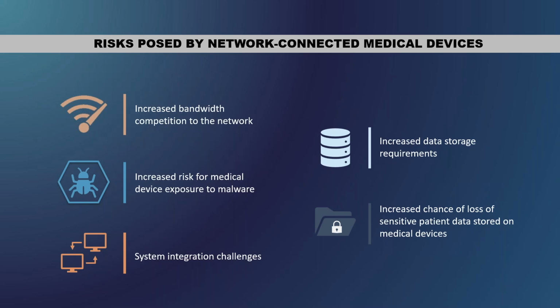Being on the network increases the risk of malware exposure when it comes to inadequate port or protocol isolation, or any physical attacks utilizing unlocked hardware ports or having access to the internet. System integration challenges come from lack of standardization or needing to implement upgrades to a set of systems and making them work with existing legacy systems. These devices might need to talk to various EHR systems and have to utilize special device drivers or other middleware.